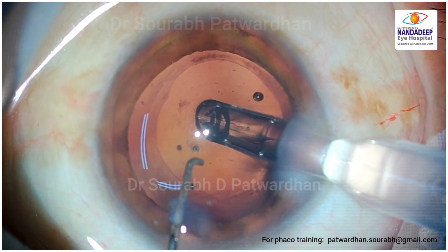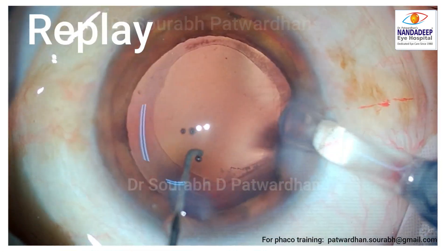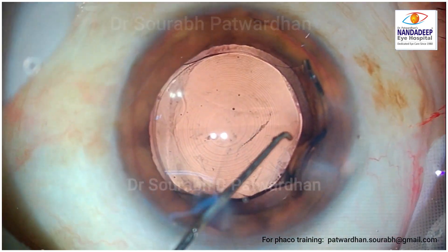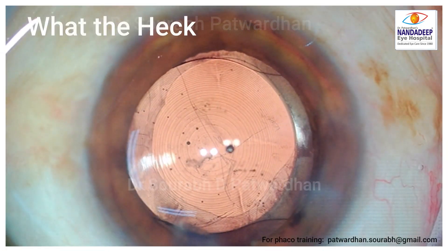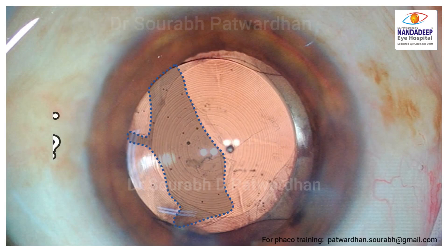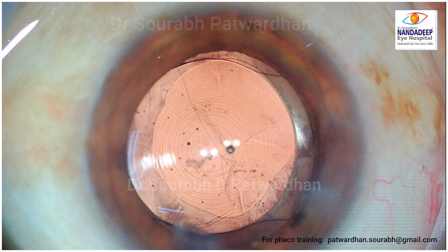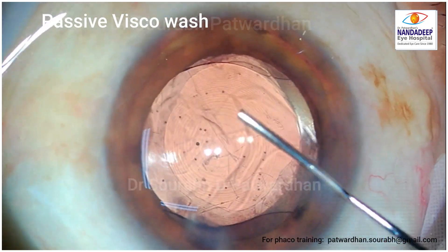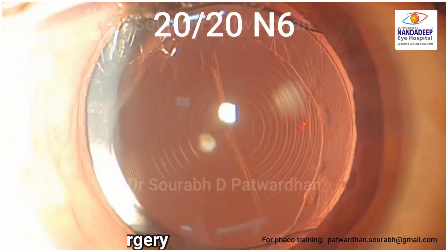Case number 5: a plate haptic trifocal IOL being placed in the bag. Watch the cartridge — the tip of the injector is right at the center of the bag. When the trailing haptics are pushed into the bag, I realized that the posterior capsule had given way while the anterior hyaloid was intact. The IOL was in the bag. The patient had already received the same IOL in the other eye and was quite happy with it. I didn't have a three-piece multifocal at this point, so I decided the IOL was quite stable in the bag and washed off the viscoelastic without deepening of the anterior chamber. At one month after surgery, the patient was doing fine.